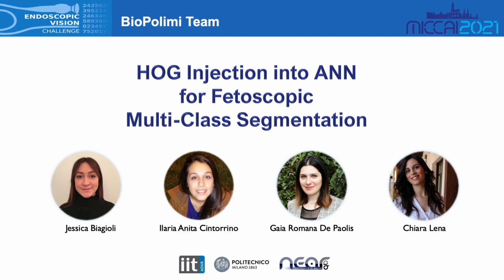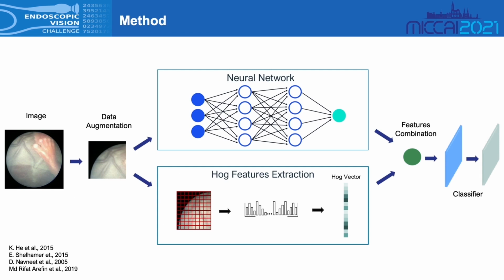This is our work for Task 1 of the Fetoscopic Placental Vessel Segmentation and Registration Challenge, where a large-scale multi-center dataset for semantic segmentation and video mosaicking algorithms in fetal environment was presented. In this work, we provide a new framework for the first task of this challenge, which is based on the combination of features extracted with histogram of oriented gradients and deep learning methods.